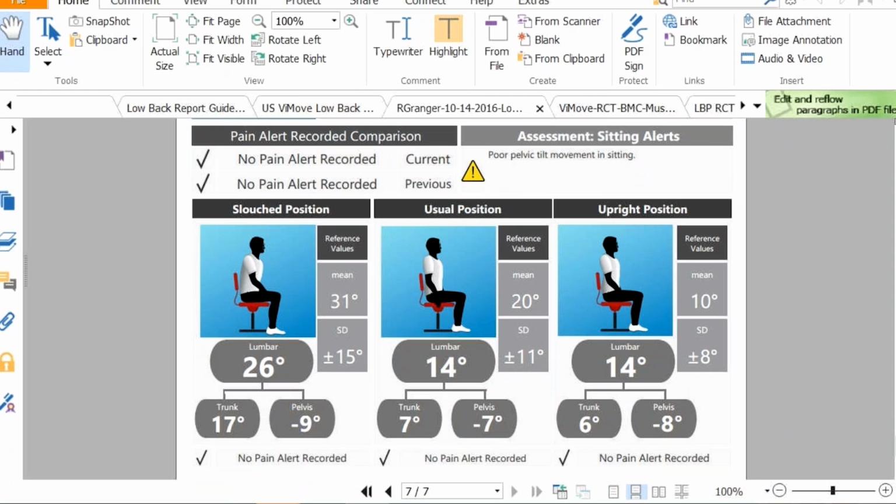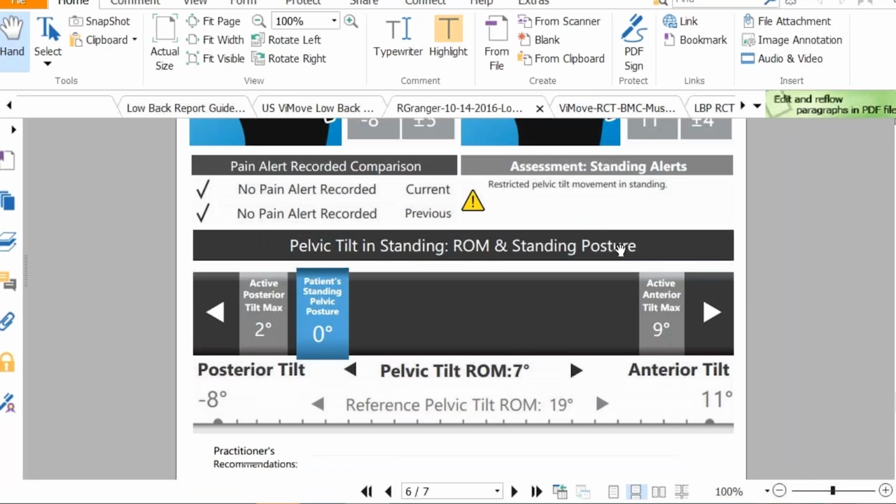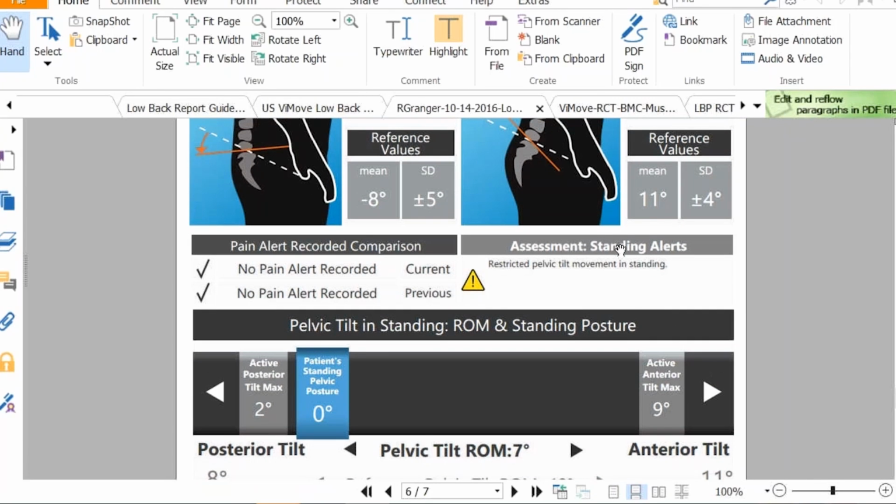And so I had to do compression on his pelvis. Then I put him on the live training and I said, can you just try and stand on one leg and see what these balls do? And he just had no concept of moving these balls around. And so you can see his standing is 7 and his sitting is 9. I mean, most people go up a lot.